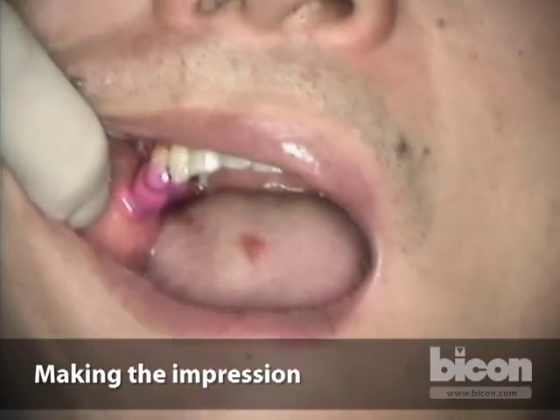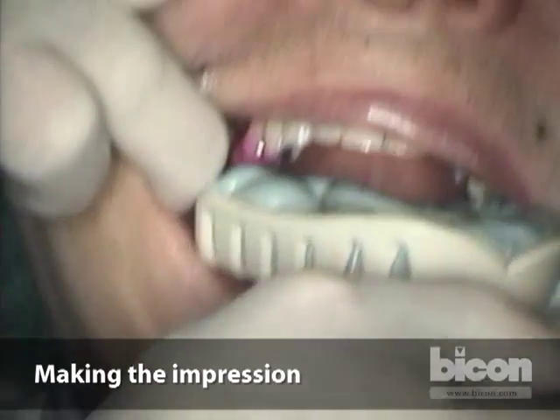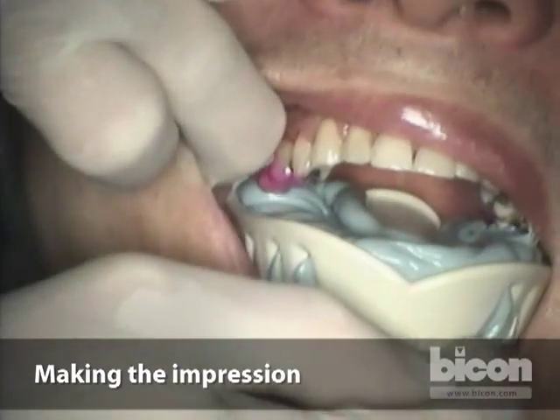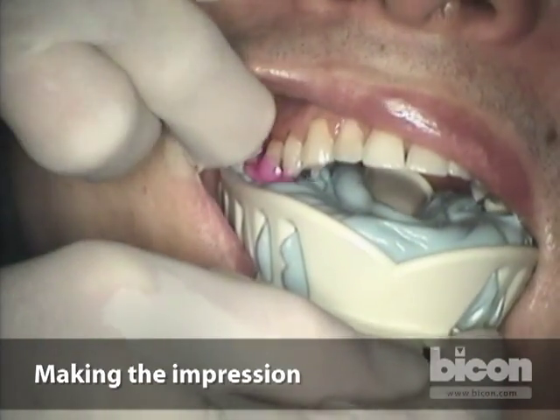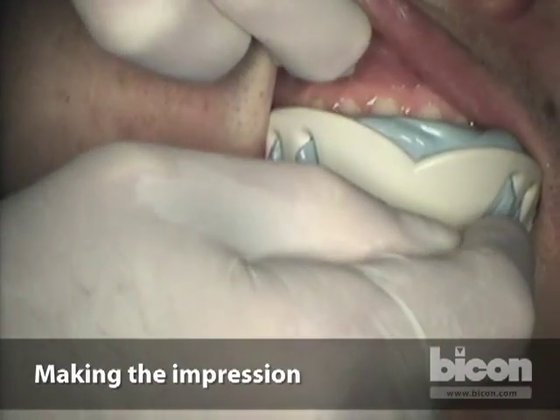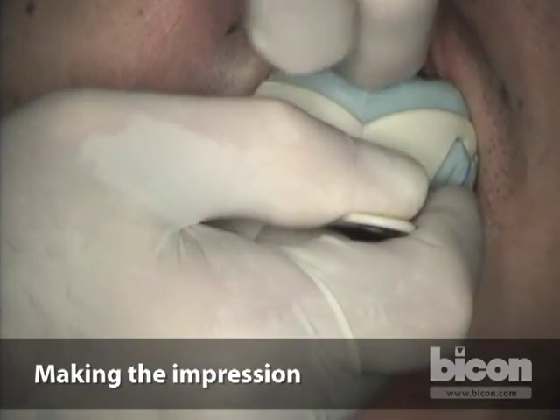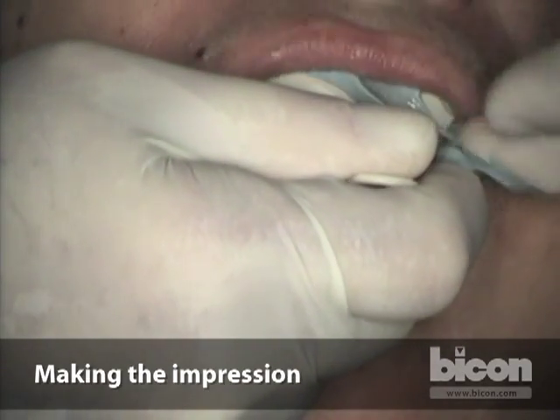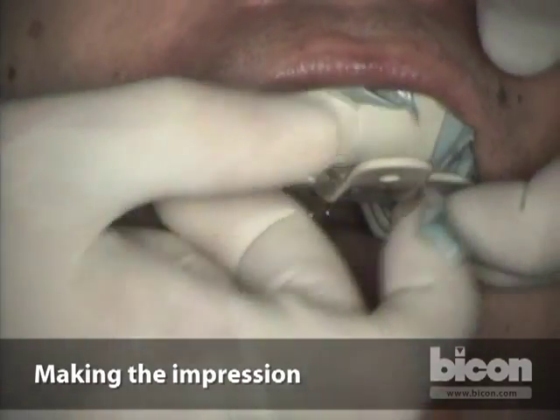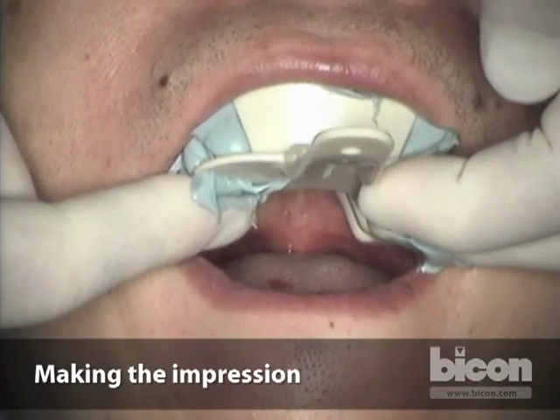Our preference is the implant-level impression. I would advise all of you that this is probably the most effective way and certainly the most cost-effective way of doing it, because the dentist needn't have an inventory of components.